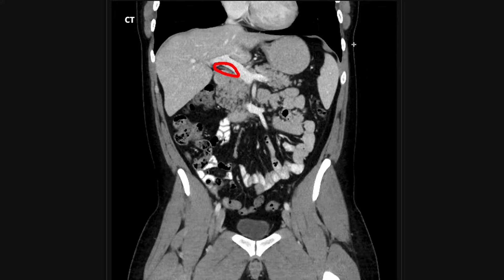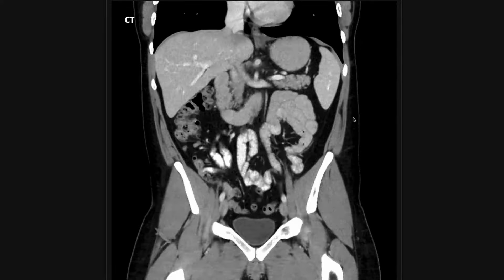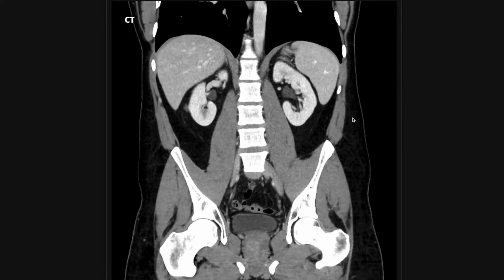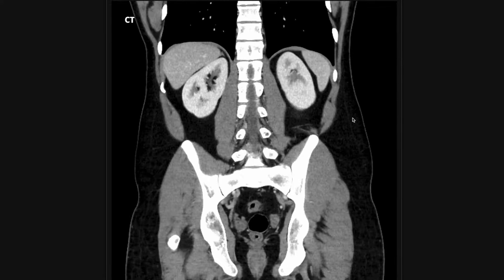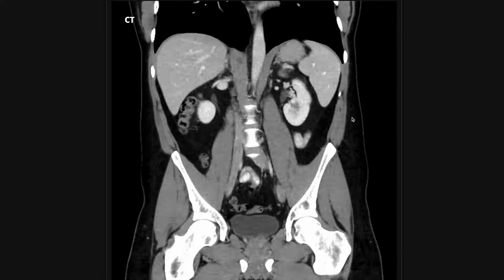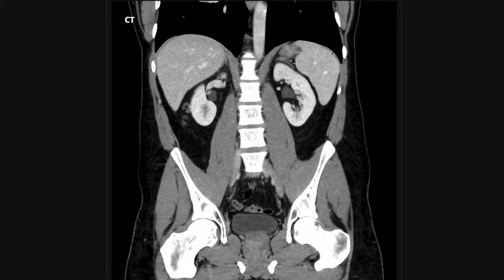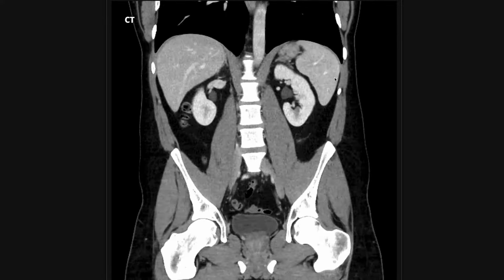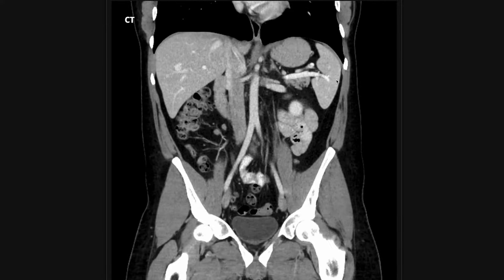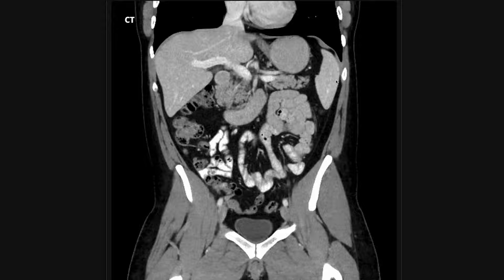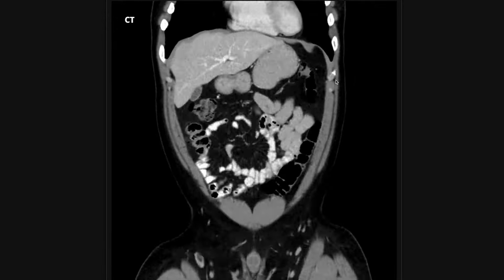I then go to the coronal view and take a look at the common bile duct, which runs just below the portal vein. In this case the common bile duct is not dilated, so it's hard to see, but it's normal caliber. I also look at the spleen in the left upper quadrant, paying attention to its size and looking for any splenic lesions.